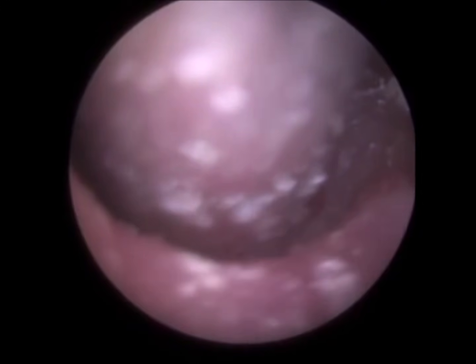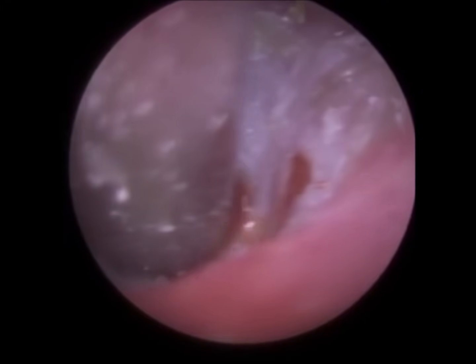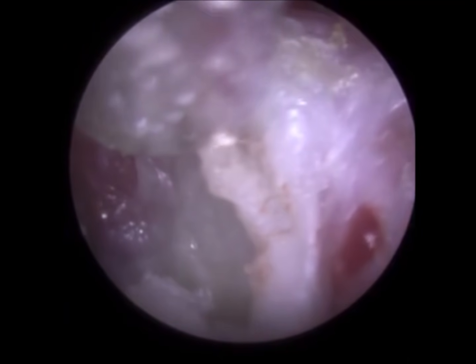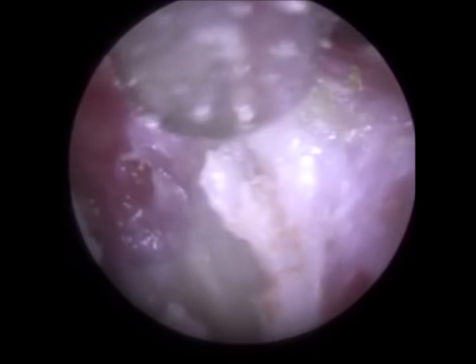Now, or from the base of the ear canal. He didn't really have a swelling, it was all keratin, hence why I don't believe it's that. So just to go back quickly, as you can see, as we remove some of this dead keratin, you're getting some of this, because this is exposing the bone now, and it's almost eating into the flesh.